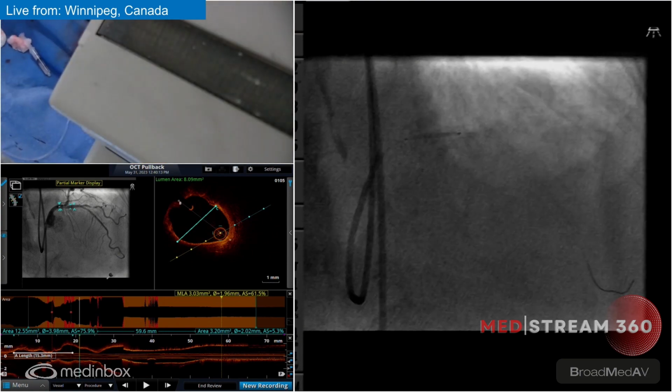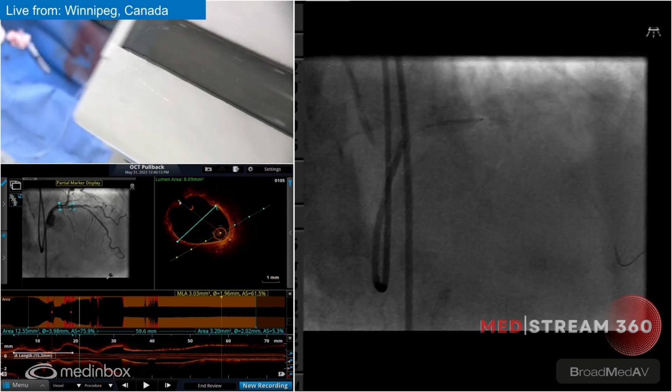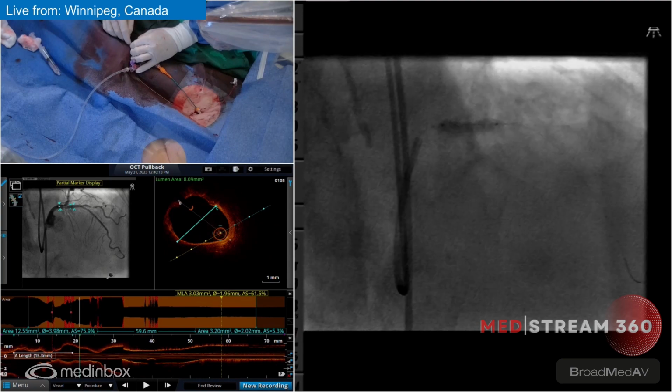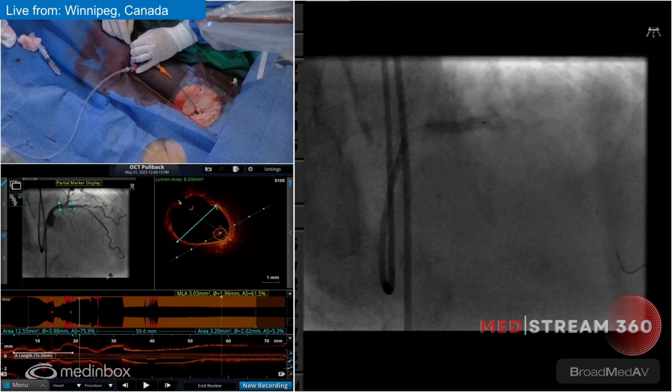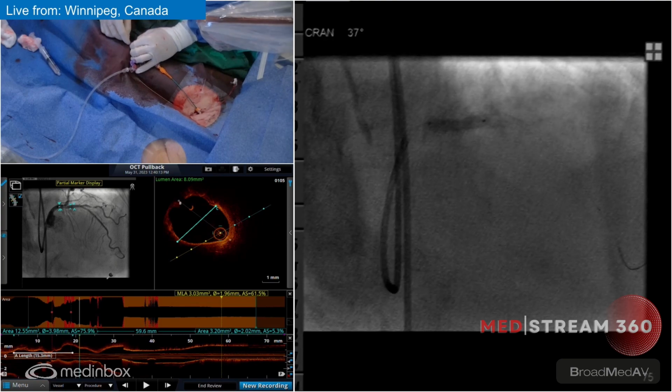Okay, let's go up 2, 4, 6, 8, 10, 12. Nice expansion. The nodular at midnight, let's go to 14. It's fighting you a little bit there. Yeah, good. Let's keep it at 14. Let's stay up for 30 seconds.